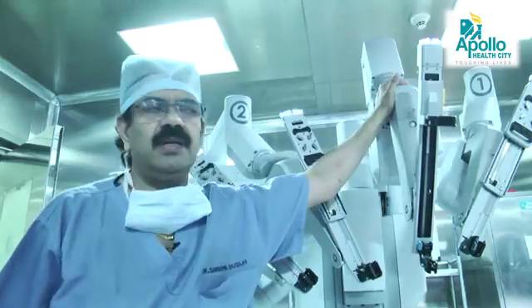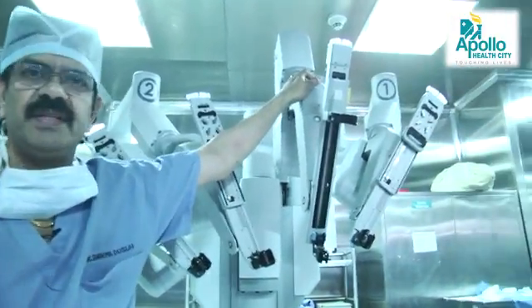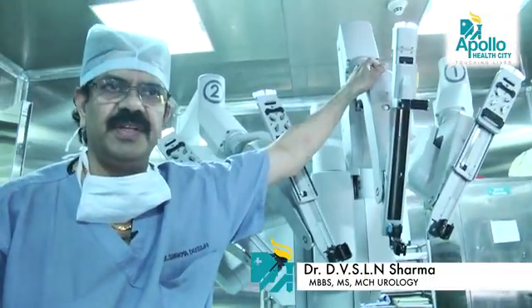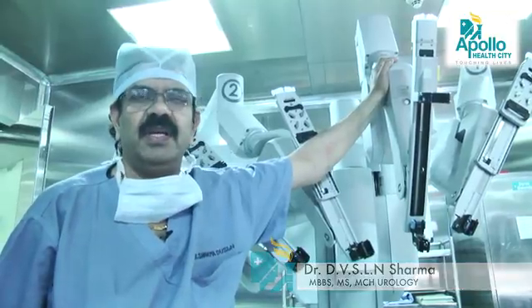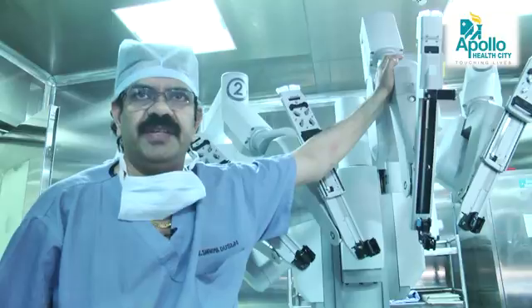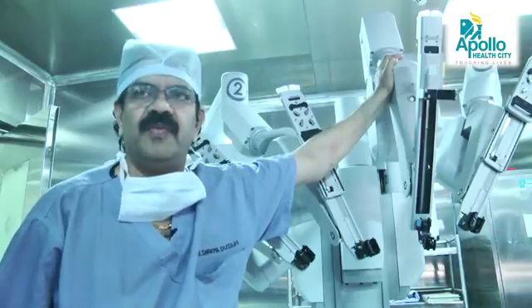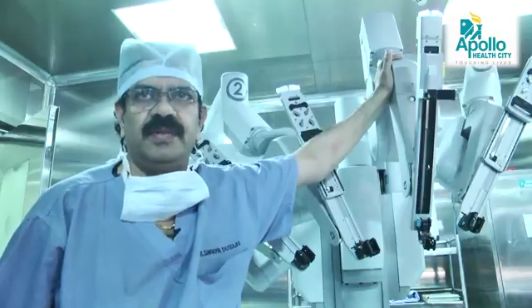There is a patient cart and the console. The surgeon sits at the console and performs the surgery. It is a master and slave system — the robot will never perform the surgery on its own. Commands are given by the operating surgeon, and the robot performs the most difficult tasks which cannot normally be performed by human beings.